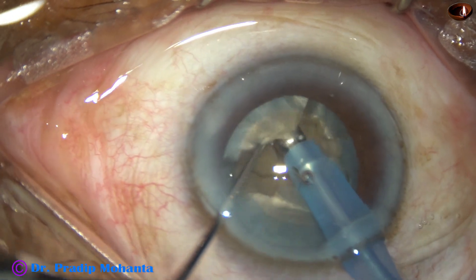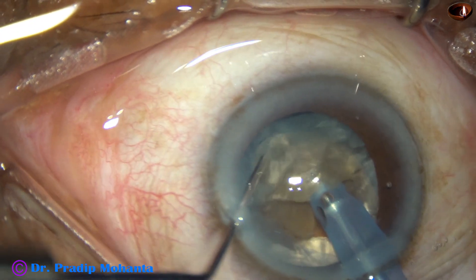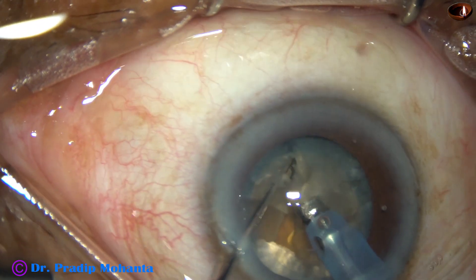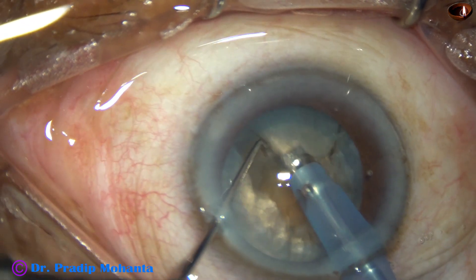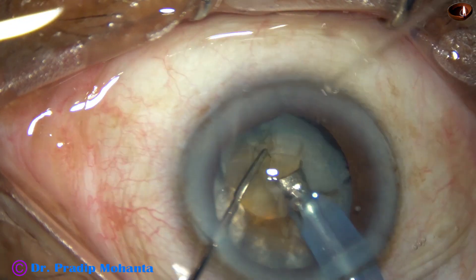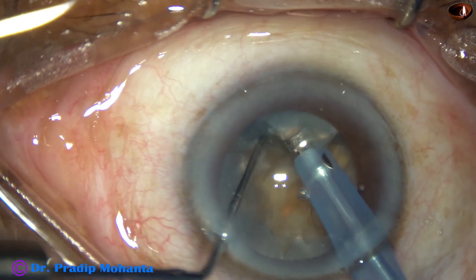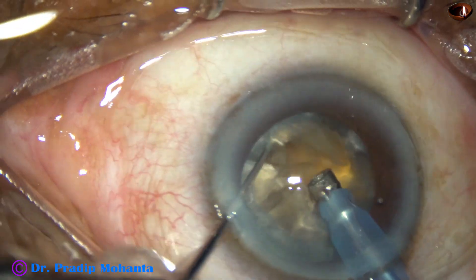The pieces are not getting separated — just some cracks. So I decided to make as many cracks as possible and manage this nucleus somehow. All the pieces are getting joined to each other centrally by a leathery posterior plate.